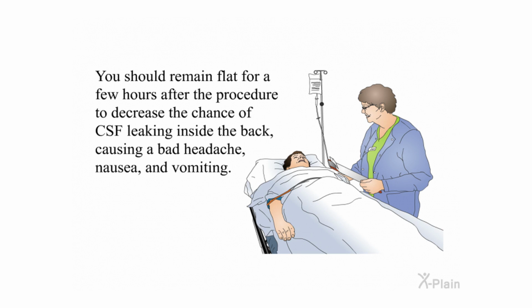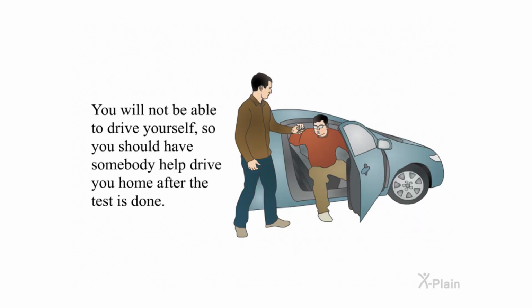You should remain flat for a few hours after the procedure to decrease the chance of CSF leaking inside the back, causing a bad headache, nausea, and vomiting. You will not be able to drive yourself, so you should have somebody help drive you home after the test is done.